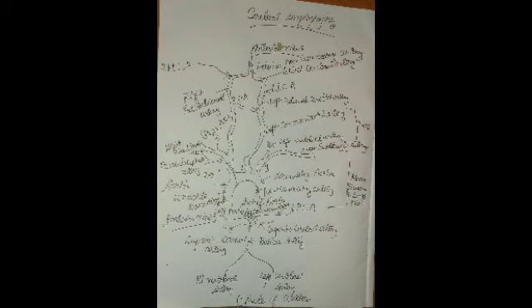When we talk about cerebral angiography, we include the four main vessels from the arch of aorta, as mentioned here. So here we get four branches. One is the right common carotid and the left common carotid in the anterior view, and in the posterior view, at the same level, we have the left vertebral and right vertebral. Together they form the four vessel angiography, or you can say the angiogram of the neck area. If it is mentioned as four vessel, you have to mention all these views.